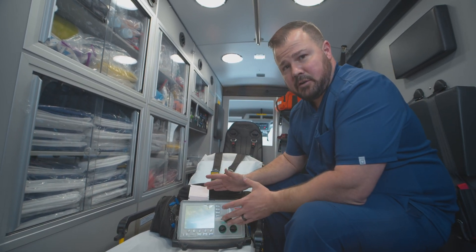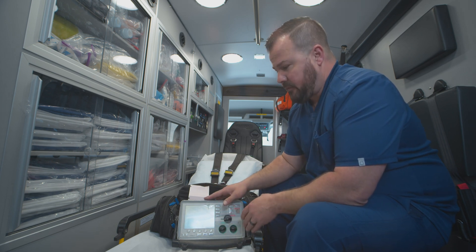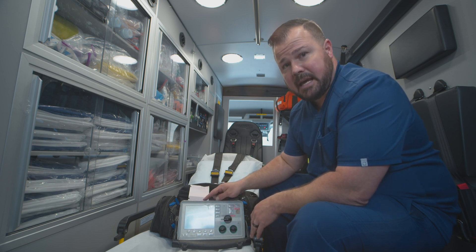At the beginning of your shift, you're going to have a daily checkout list. On the back of that list, you have a defib test that you have to do. It tells you to go ahead and check the defib function on this at 30 joules.